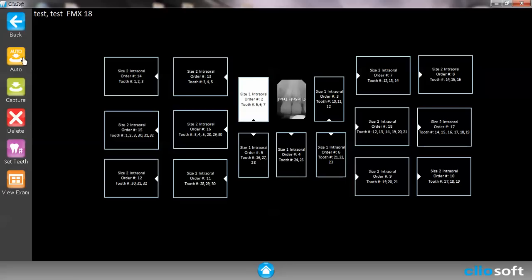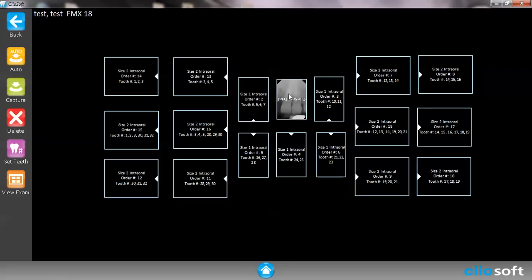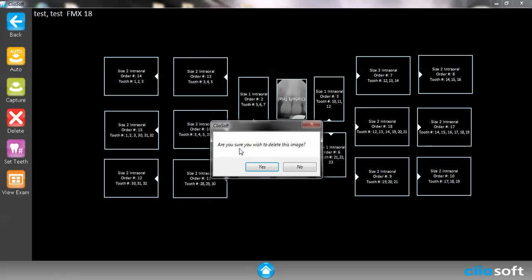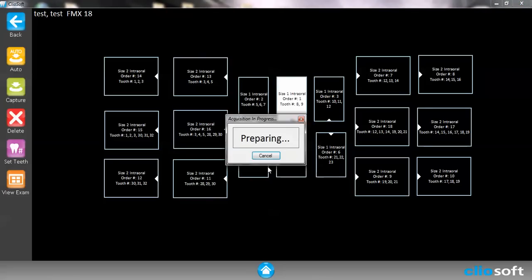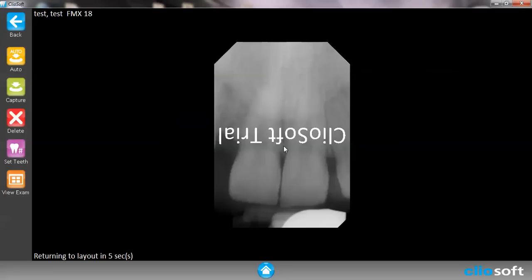Let's say that you have taken a picture and you don't like it and you would like to retake it. If you click over the picture that's already been taken and double click it, it'll ask if you want to delete the image. You hit yes and then it's ready to take another x-ray.